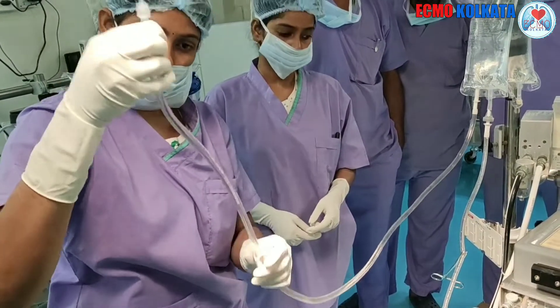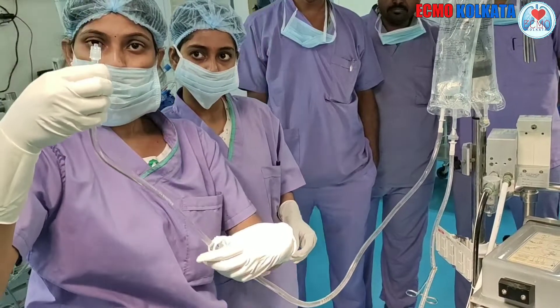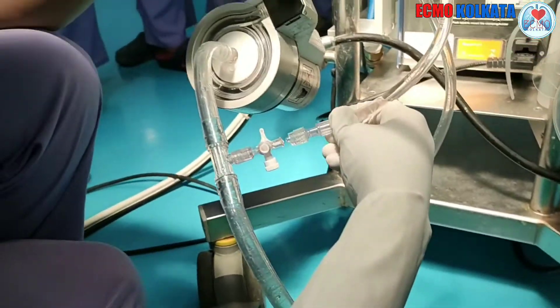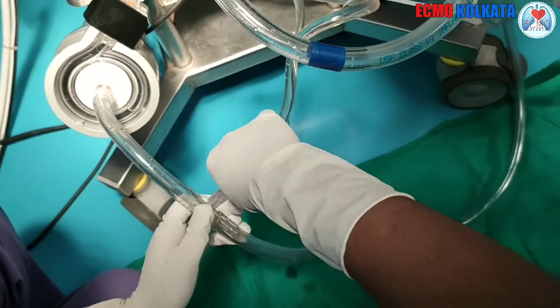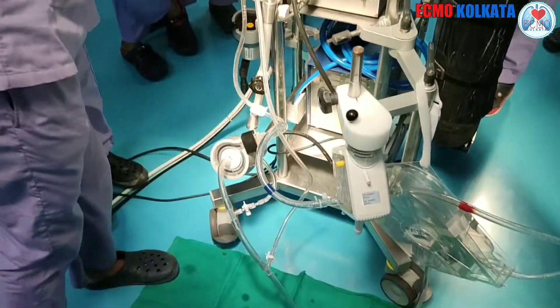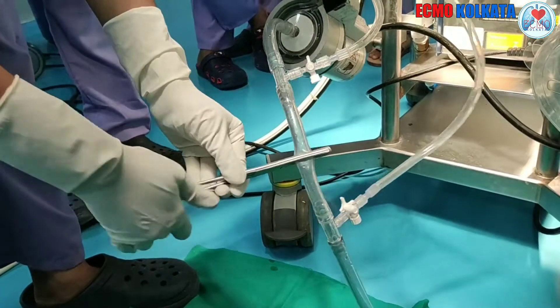This is done for priming the circuit without any form of bubbles or air trapped inside it. When it is primed, the line is clamped and it is connected to the proximal port once again.